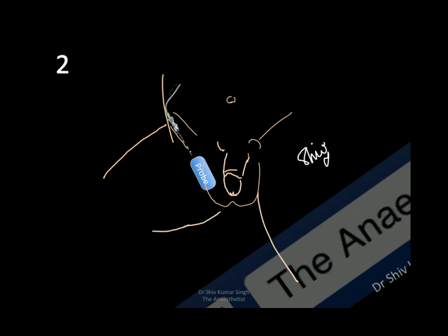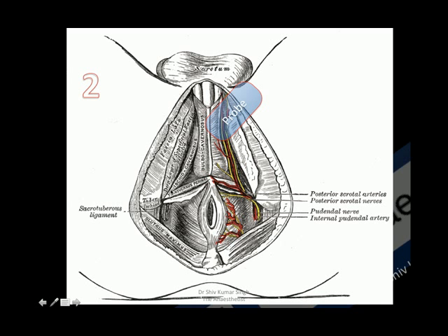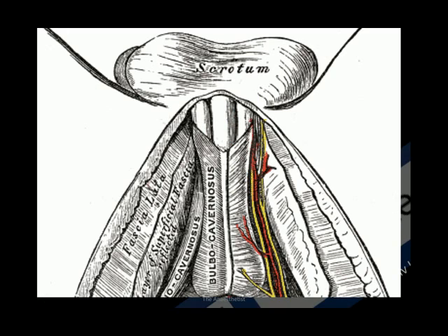The perineal branch of the pudendal nerve can also be blocked under ultrasound guidance. For this, the leg needs to be placed in a frog-leg position and the probe is placed in the groin, slightly lateral to the scrotal skin, going deeper toward the pubic tubercle and inguinal crease. The approach is from lateral to medial — more of an anterior-posterior oblique approach to the perineal branches. In this area you will see a lot of fascia and fat, and you can see the posterior scrotal nerves and arteries traveling, though the arteries are very small and sometimes not visible.